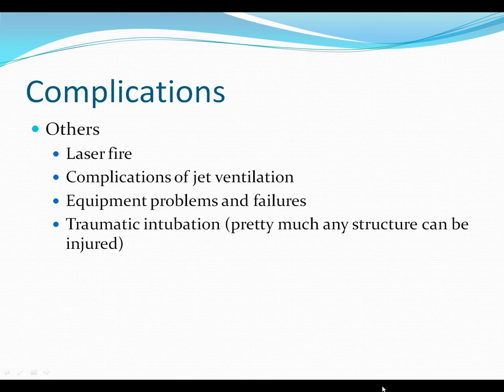Traumatic intubations. When you look at a list of complications, there's about 20 different structures that can be traumatized during intubation, from the most common, teeth, to nerves, blood vessels, you name it.